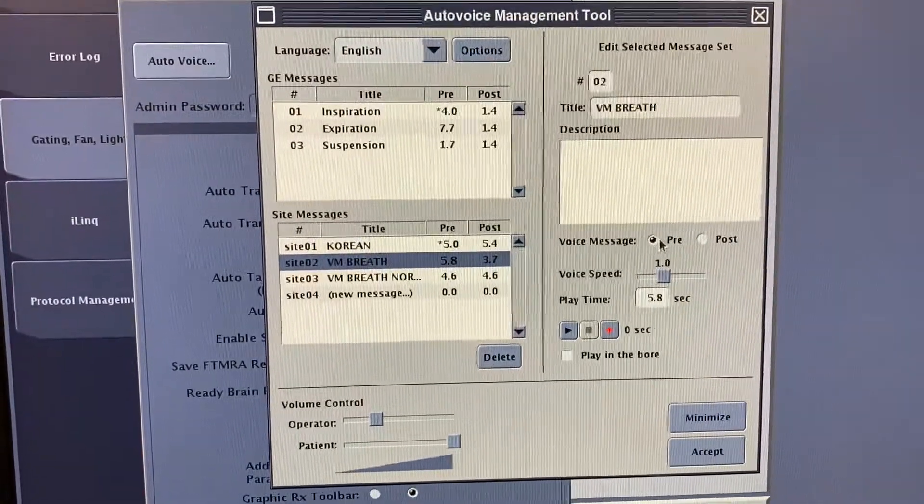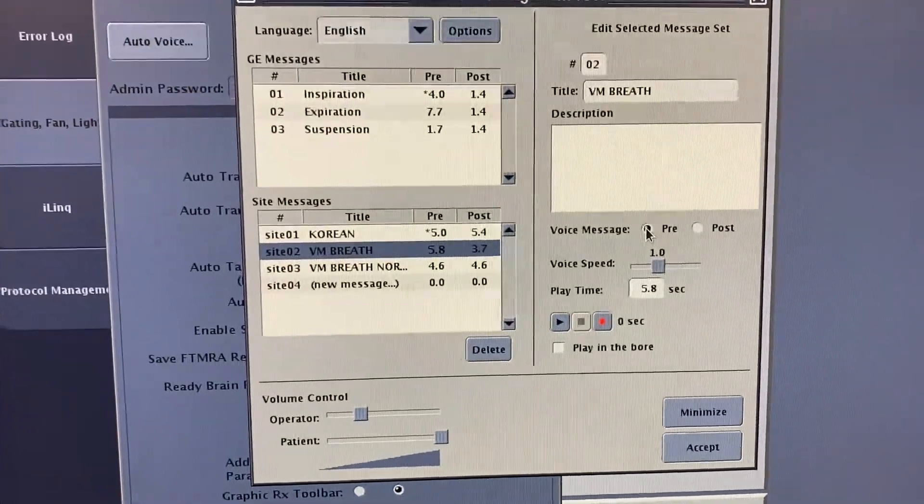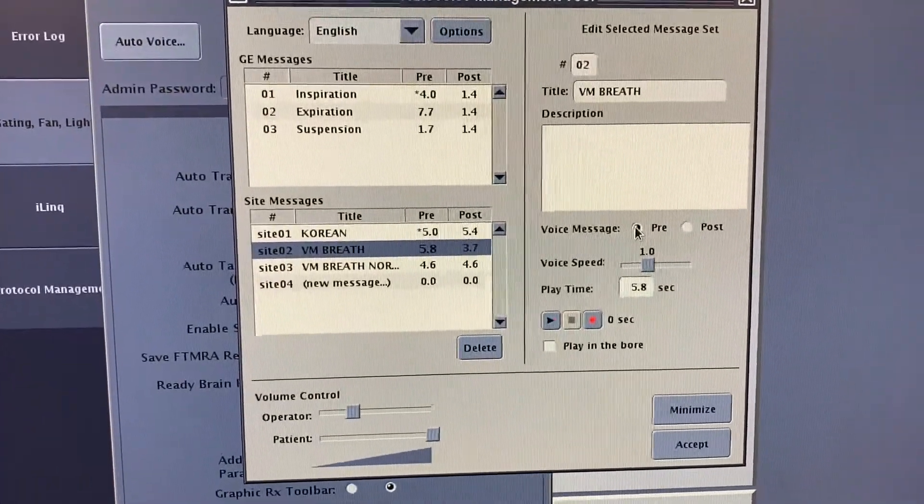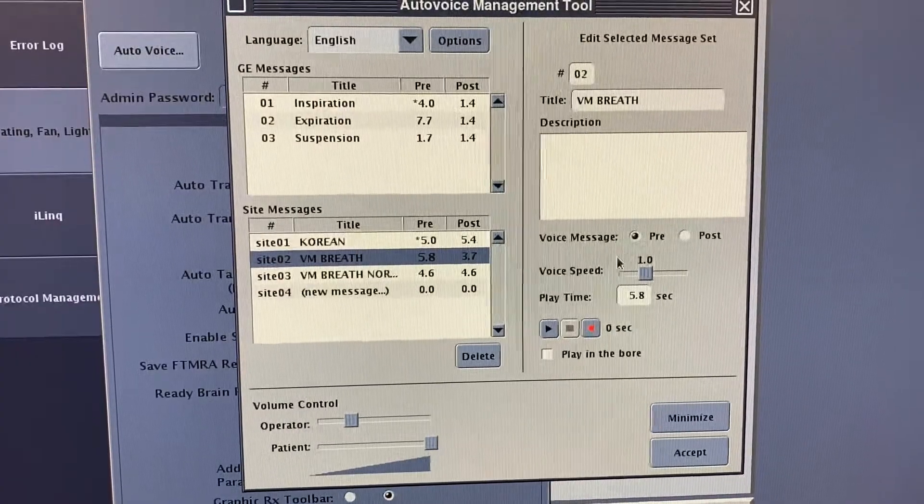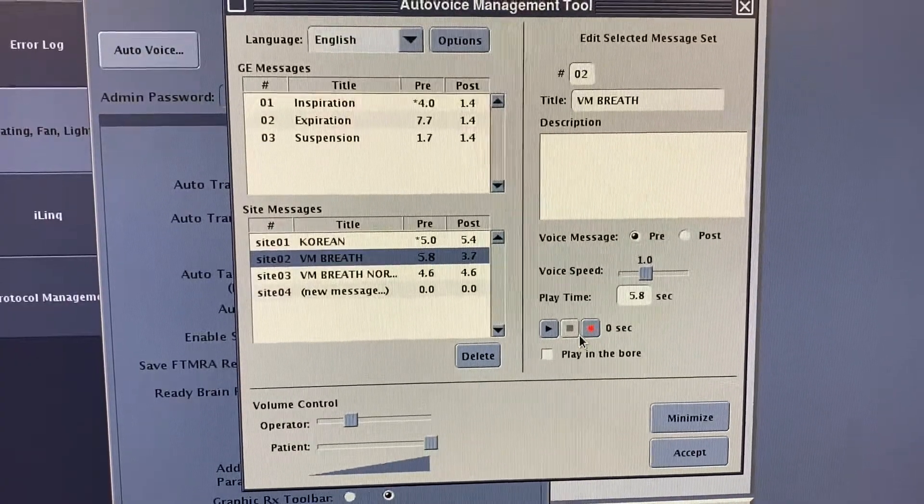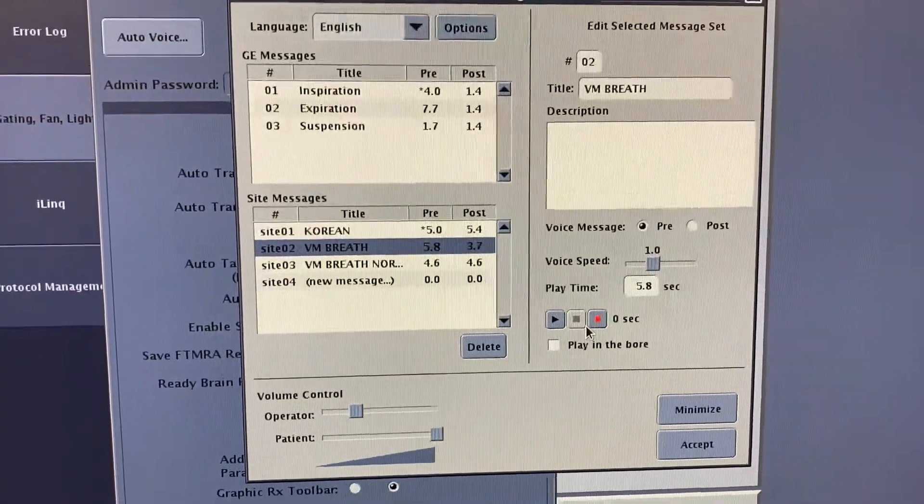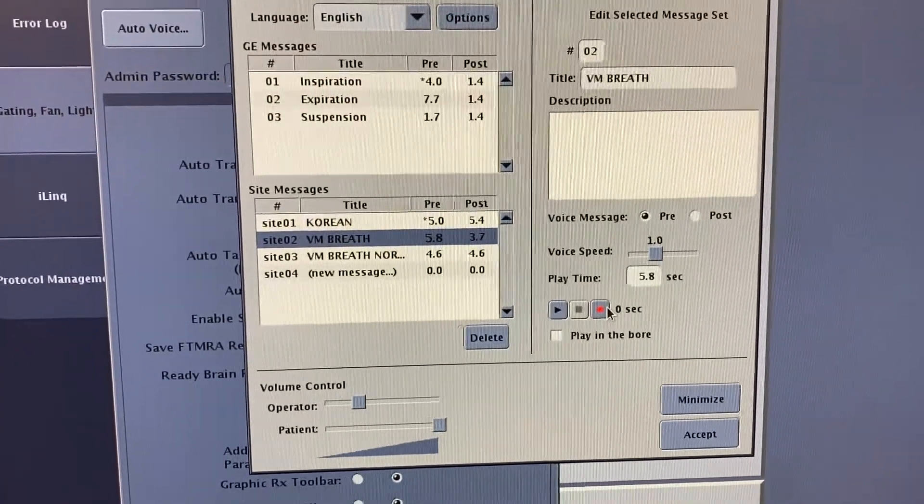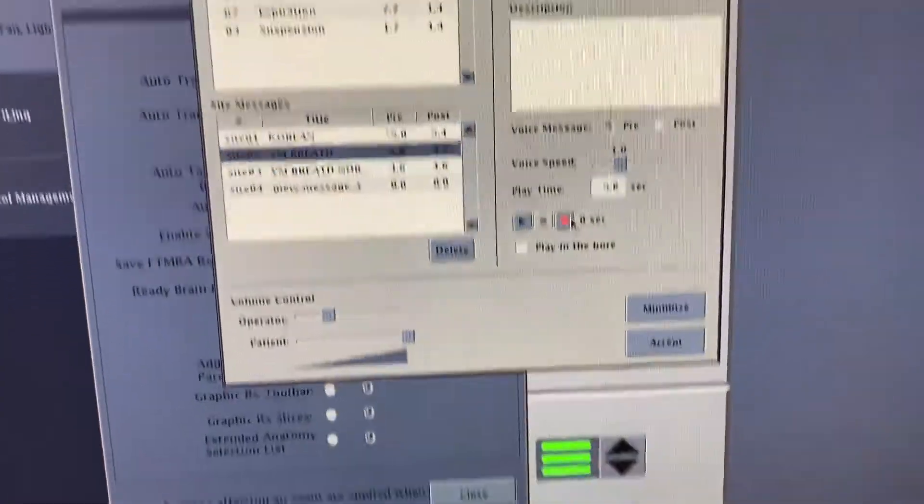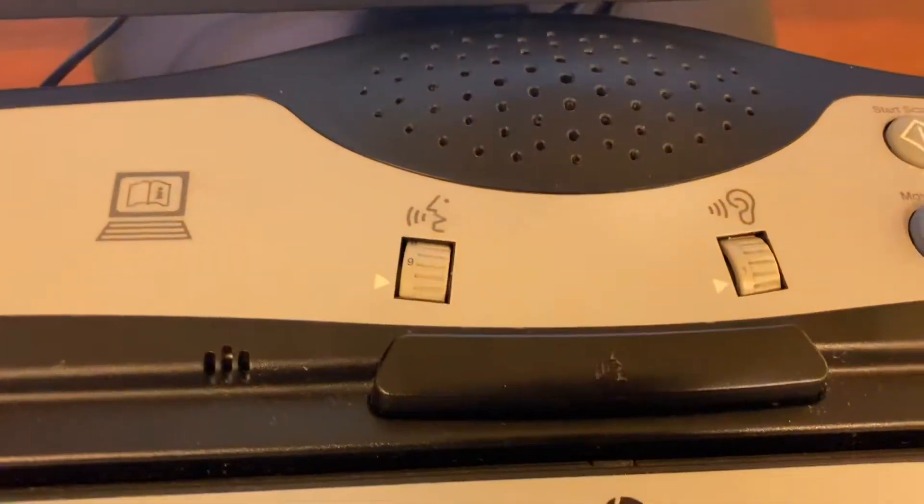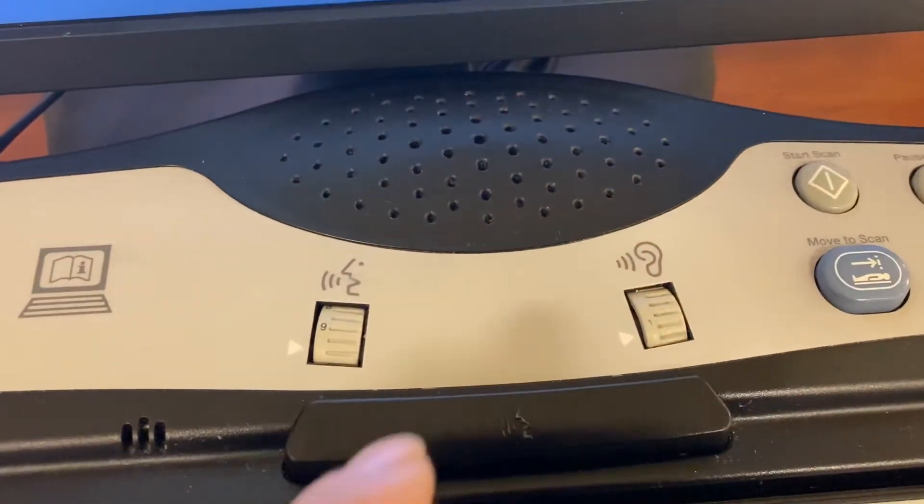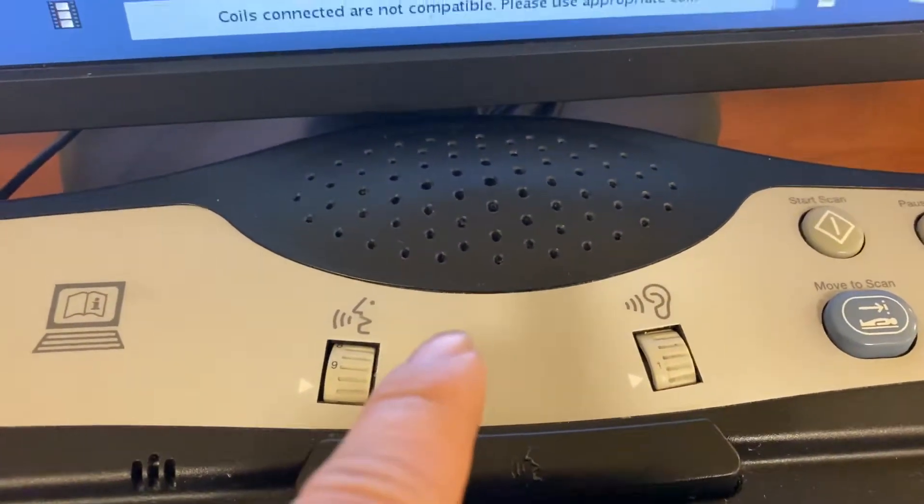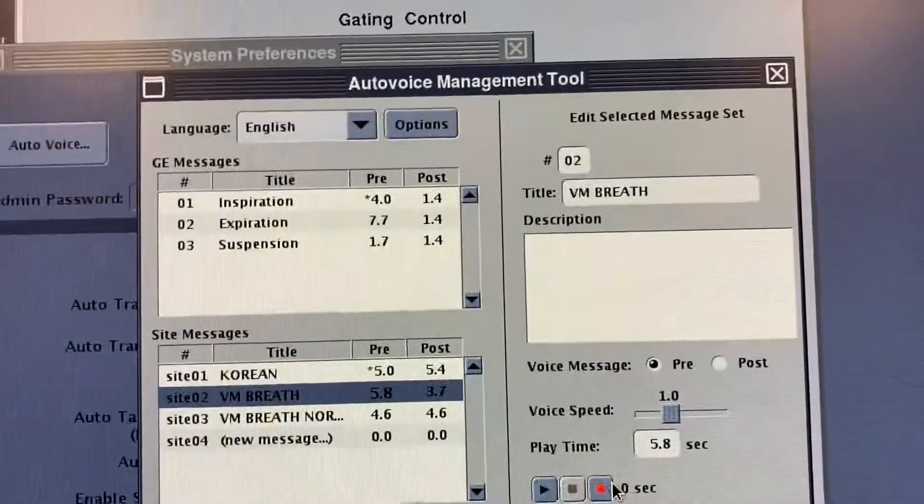You want to record one for the pre. When you do want to record pre, go hit this button here. It's going to automatically - sorry, hit the red button to record. You're going to see a counter starts going.